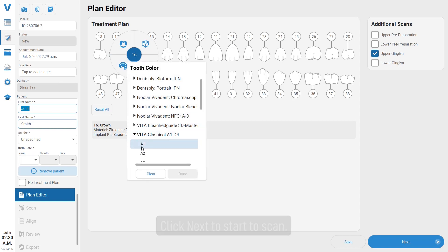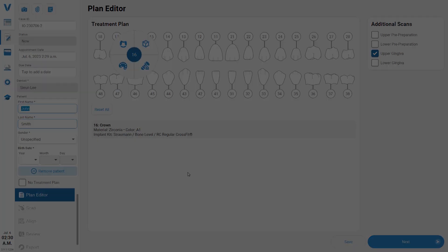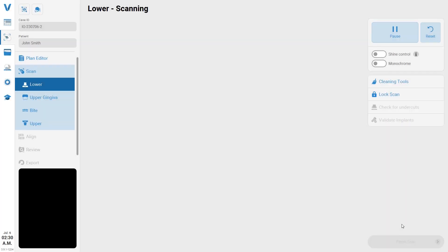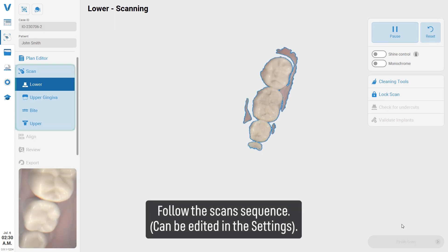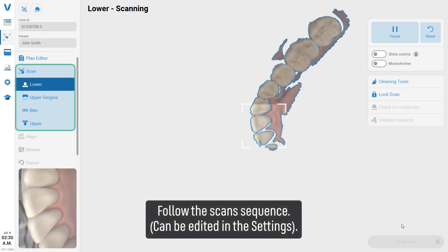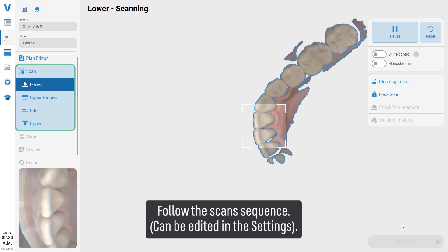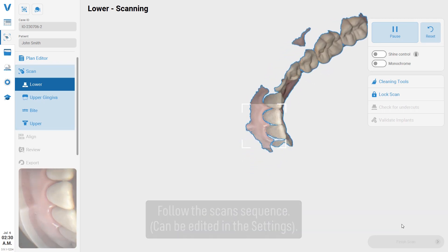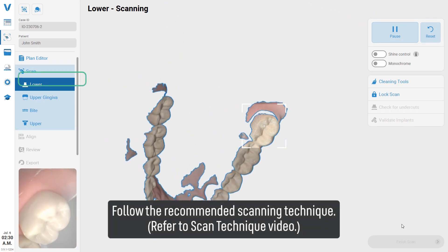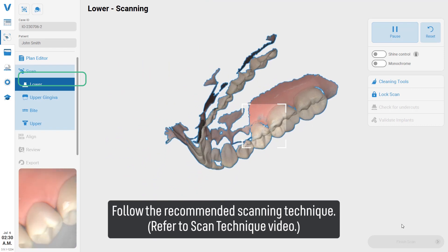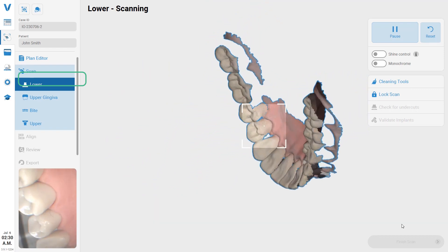Start to scan and follow the scan sequence, which can be edited in the settings. Follow the recommended scanning technique — refer to the scan technique video for guidance.